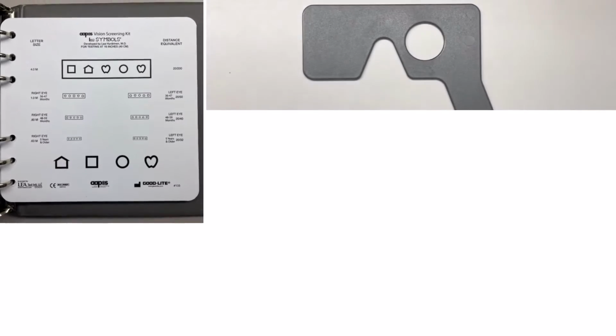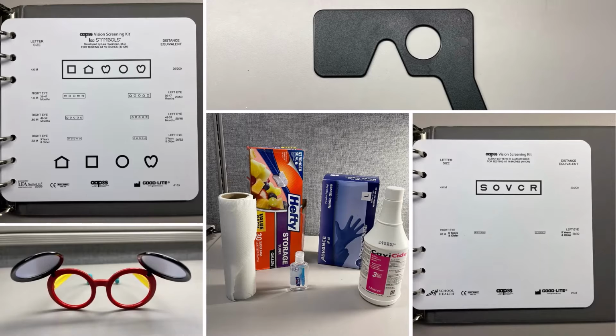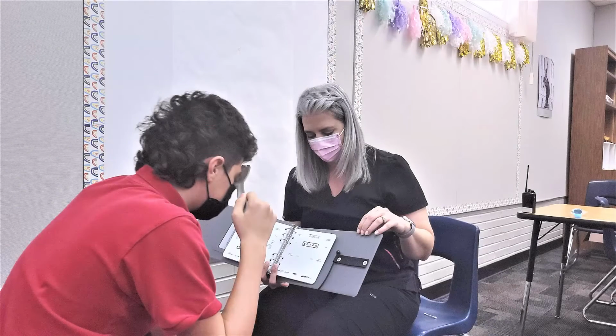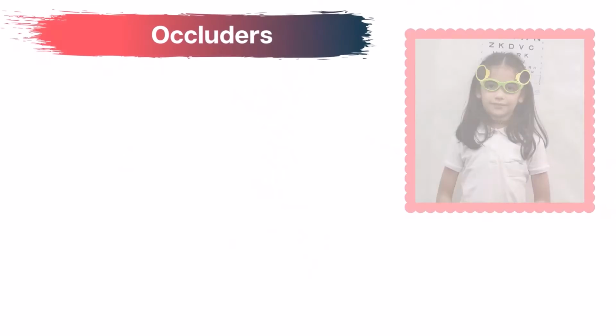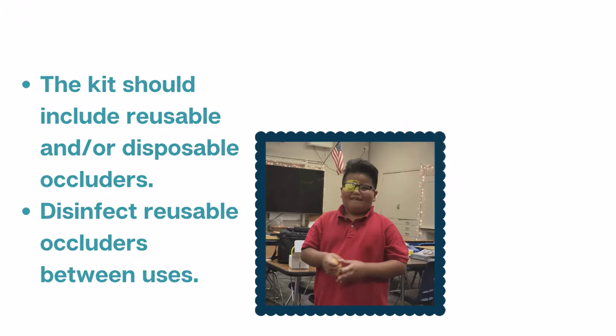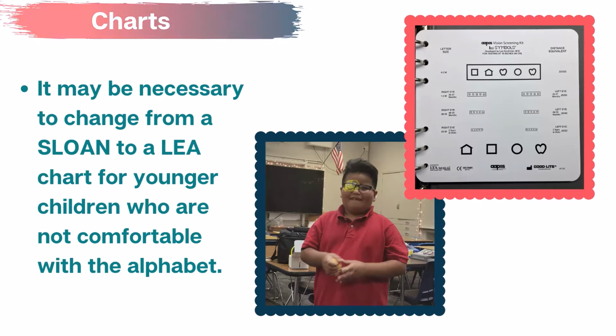Vision screening tools for near visual acuity include near visual acuity charts, most will include a measurement instrument, and occluders. The tools and equipment used are similar to those in distance visual acuity screening. Here, we use smaller versions of the acuity charts, LEA or Sloan. Each kit should include reusable and disposable occluders. Remember to disinfect the reusable ones after each child. Ensure that the child is comfortable with the alphabet before using the Sloan chart.